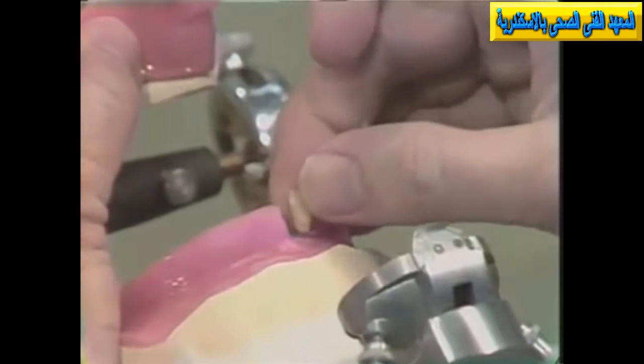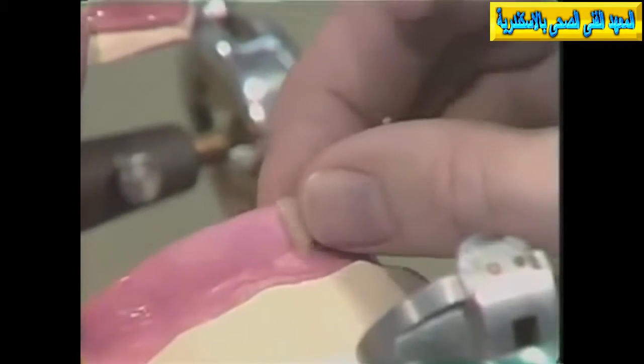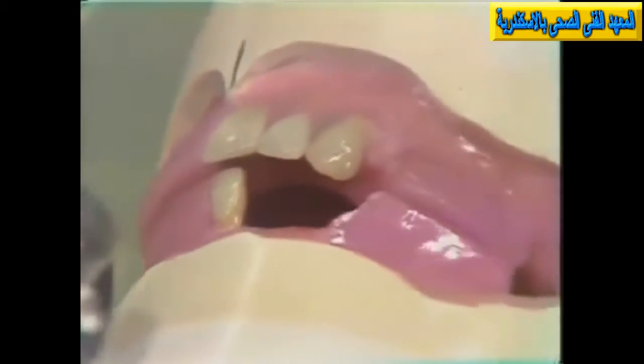After placing a small amount of molten pink baseplate wax with the number 7 wax spatula, the mandibular central incisor is positioned. The tooth is placed with the incisal edge even with the mandibular bite rim and with the neck of the tooth inclined toward the labial part of the residual ridge. The facial surface of the tooth is tipped slightly to the labial, thus maintaining the continuity developed by the mandibular wax bite rim.